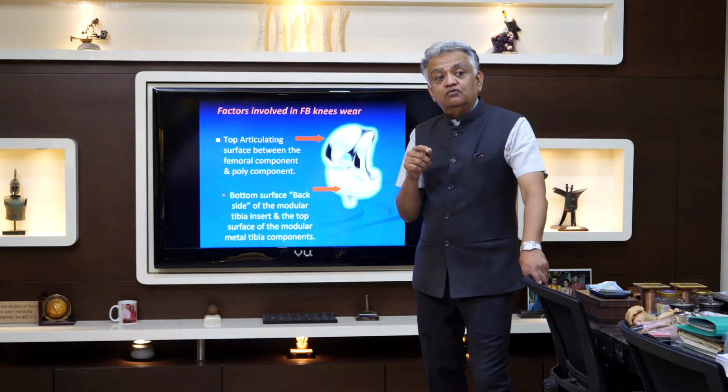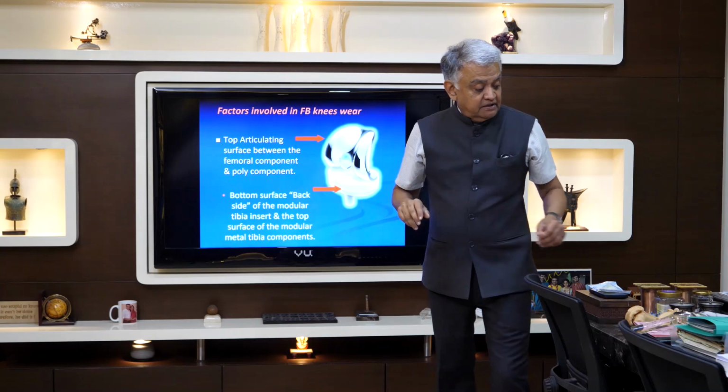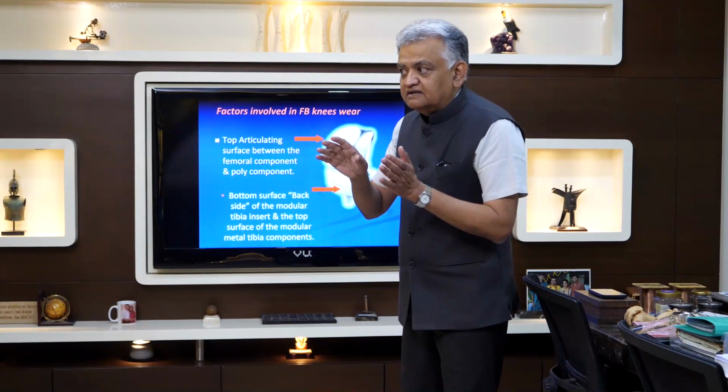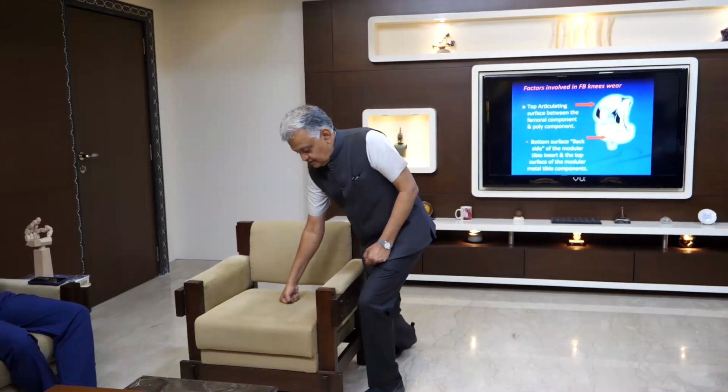In the knees, bone destruction was happening due to mechanical reasons rather than histiocytic responses, like in the hip, as you saw. Why? Because in the knee, the plastic fails, and this is a good example of one retrieval, which I'm passing around. Just look closely at the visual things that you'll see here. In the knee, the plastic fails by what is known as subsurface cracking. The stress points are the stress points. If, for example, this is your knee surface, and there is a pressure point here, the breaking happens. It's not the rubbing which destroys it. It is this deformation, just a few microns underneath the surface, where there is a crack. So there is a crack here, a crack there, and then they join together and it comes off like a laminate.